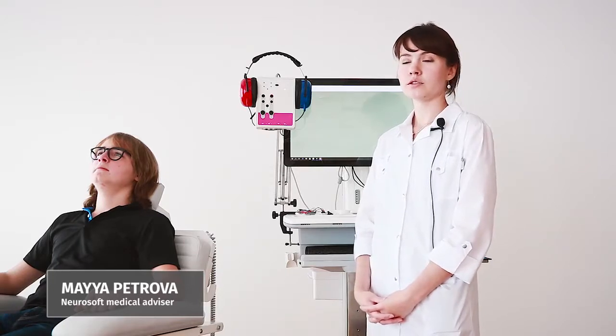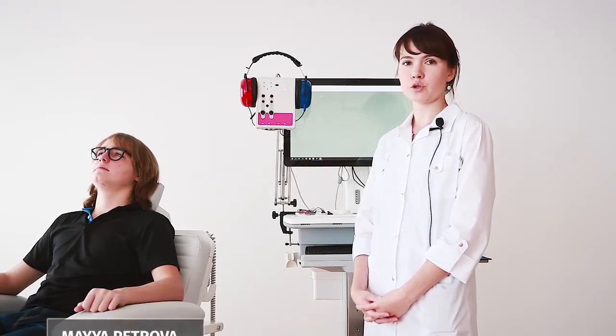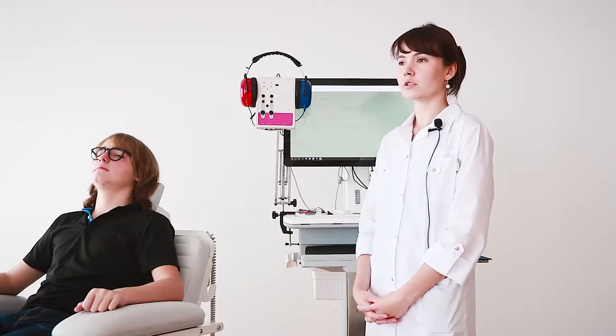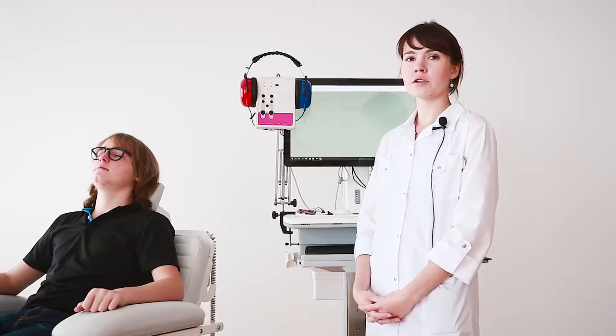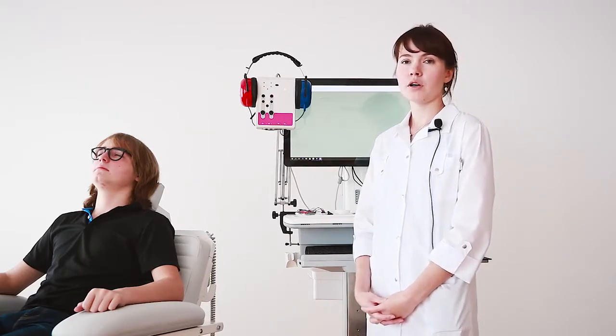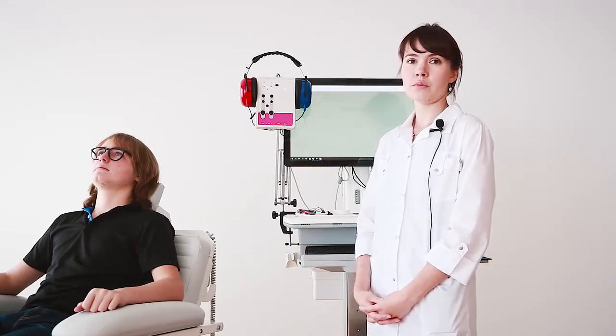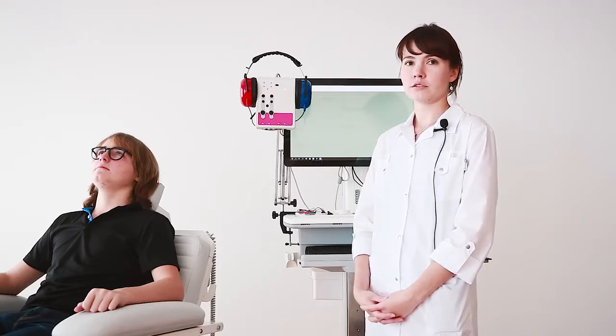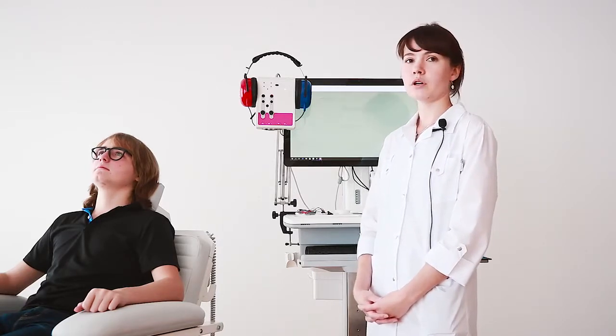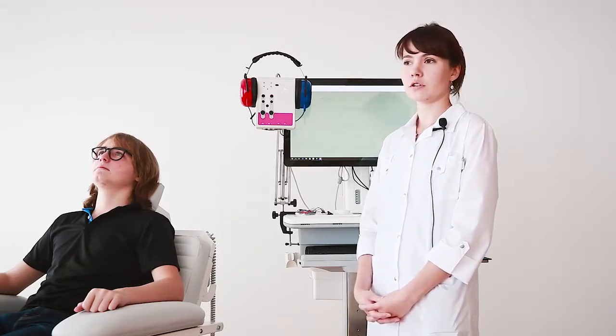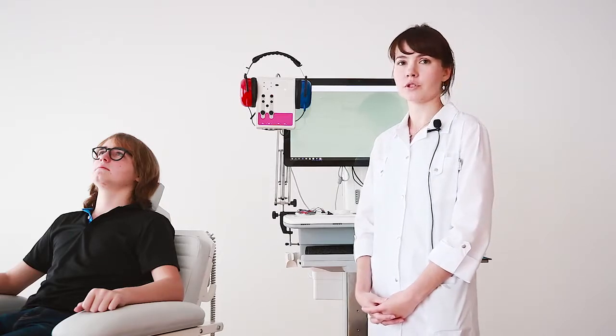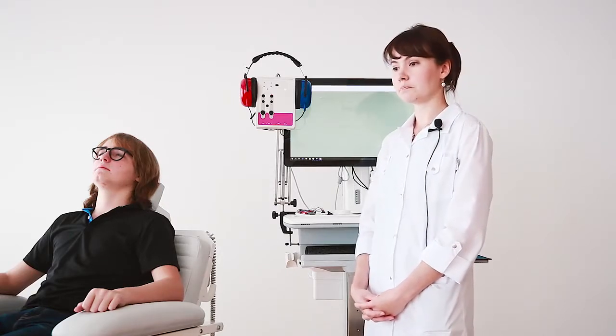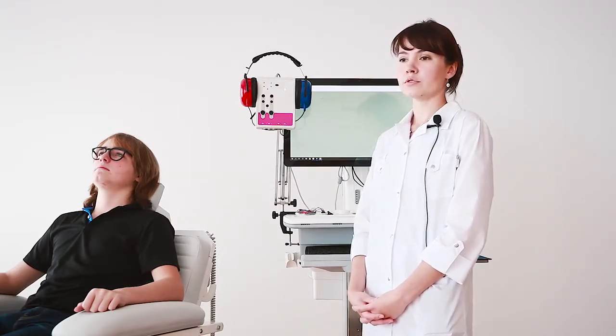Now let's perform vestibular evoked myogenic potential tests. Near Audio allows us to perform different types of such tests, for example cervical VEMP or ocular VEMP and electric VEMP. Today we will perform cervical vestibular evoked myogenic potential tests.